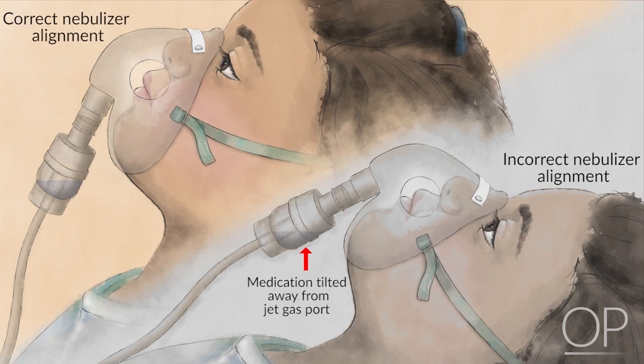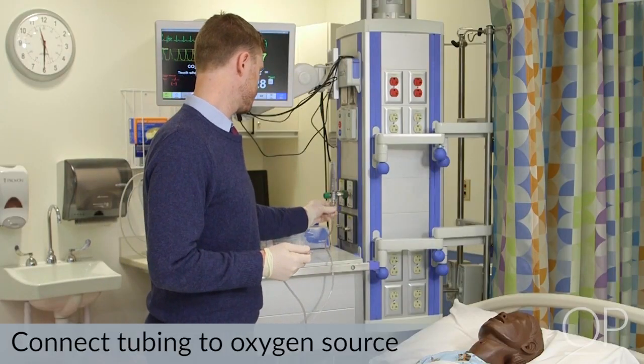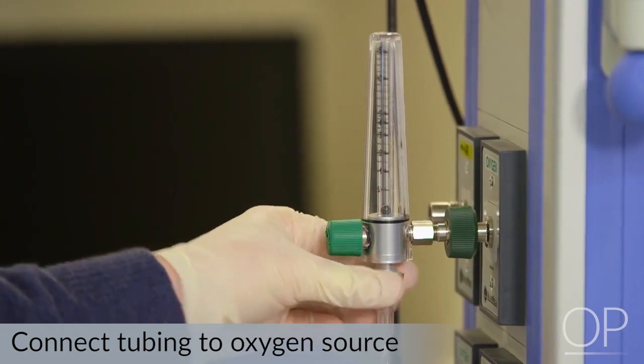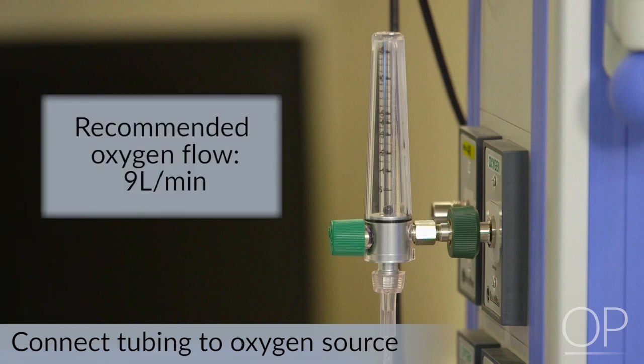If you notice a treatment you are administering is taking a long period of time, or there doesn't appear to be an appropriate volume of aerosol generated, you may want to check the nebulizer to ensure proper vertical orientation. Next, I'm going to connect the nebulizer to our gas source using oxygen tubing. It should be noted that in order to adequately power jet nebulizers, a specific gas flow is required for this device. The manufacturer in this case recommends 9 liters per minute.